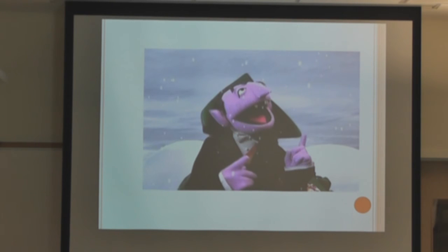But if you had a score, you would probably have two numbers, because you have your 37-degree score and your antihuman globulin score. Like I said, you may actually theoretically work someplace that doesn't even worry with the score. They just tell you what the titer is.